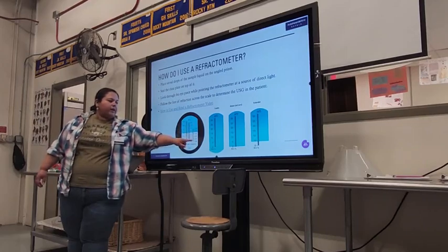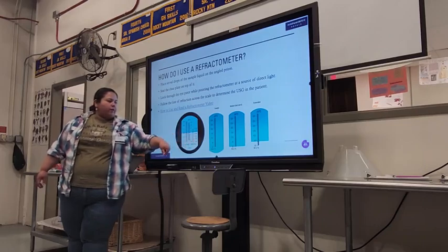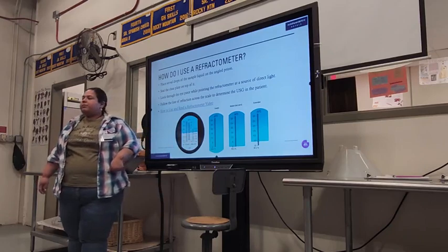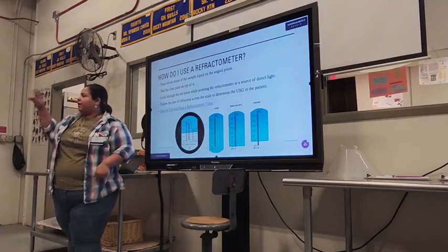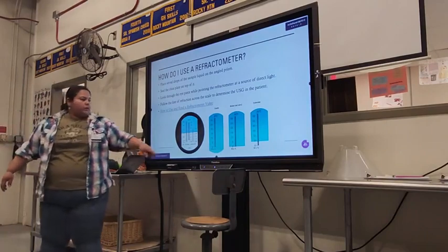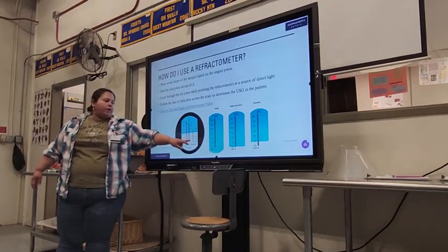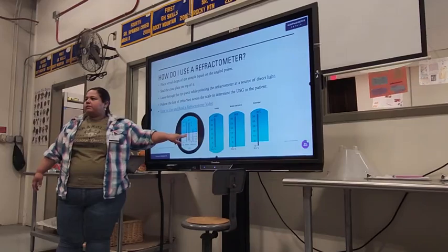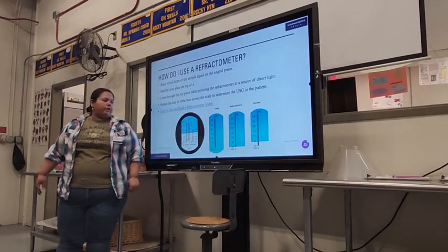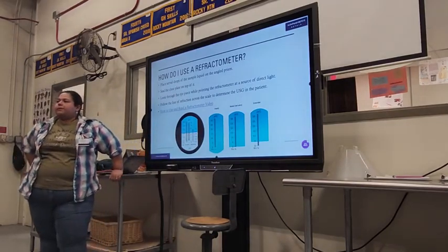everything is in increments of 10, right? 1.0, 1.01, 1.02. So we have 1, 2, 3, 4 hash marks there, which typically indicate that there are 5 spaces there, meaning that each space is valued at a 2. Okay? So if you look at the picture here, we're right above the 1.03. What is the value of this particular sample here? Can anybody tell me? Does anybody want to come up and take a closer look if you're having problems seeing?